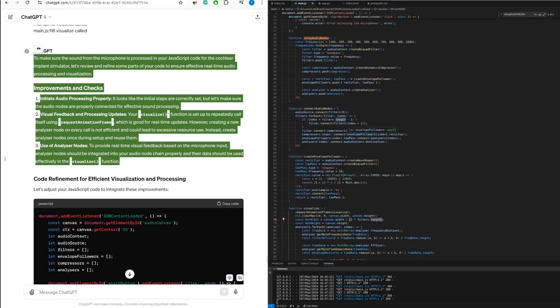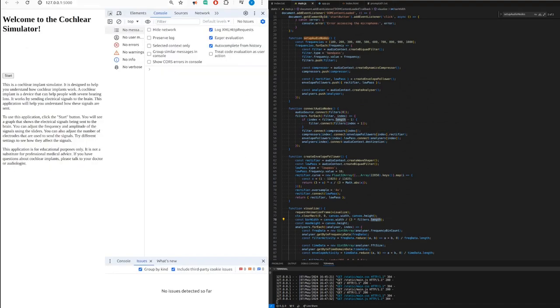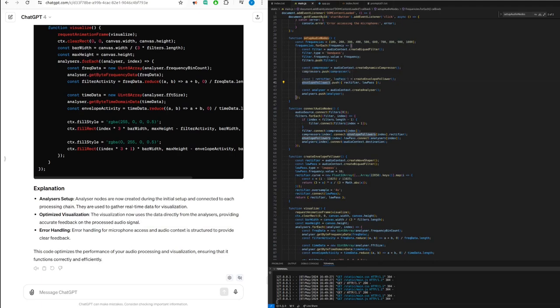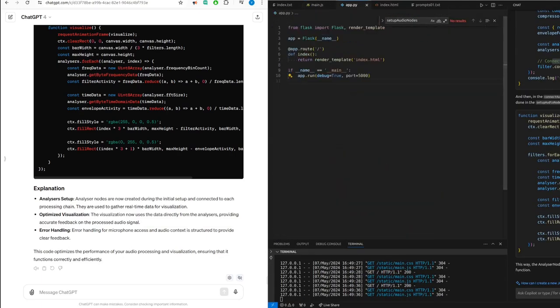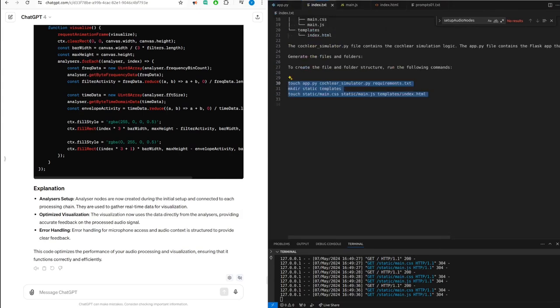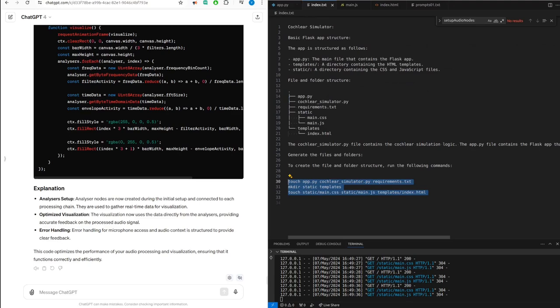To provide real-time visual feedback based on the microphone input, analyzer nodes should be integrated into your audio node chain properly and the data should be used effectively in the visualize function. Analyzer setup. Analyzer nodes are now created during the initial setup and connected to each processing chain. They're used to gather real-time data for visualization. Optimized visualization. The visualization now uses the data directly from the analyzers, providing accurate feedback on the processed audio signal. Error handling. Error handling for microphone access and audio context is structured to provide clear feedback. This code optimizes the performance of your audio processing and visualization, ensuring that it functions correctly and efficiently.